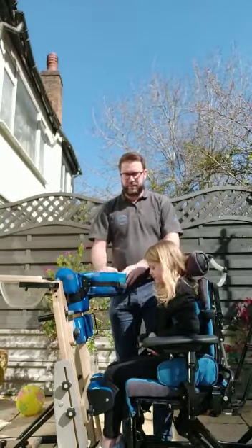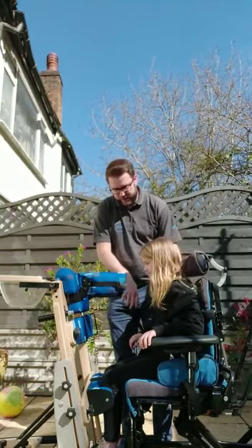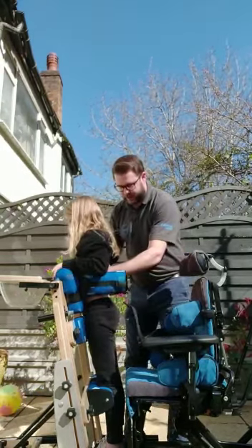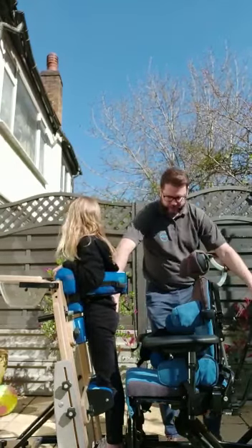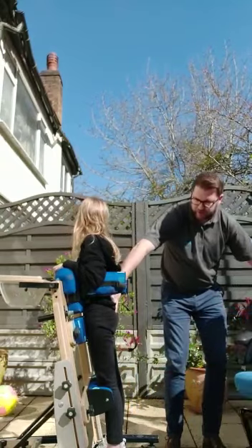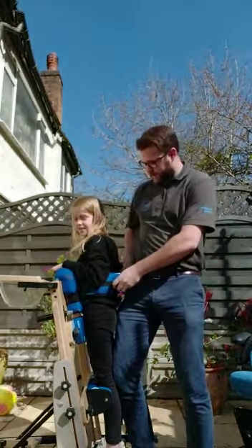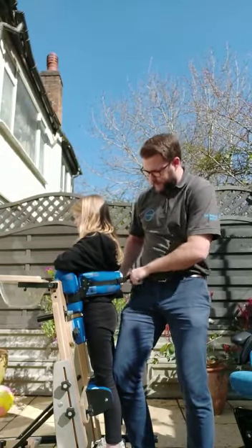But if your child is able to help you, come to the side and lean them forward, and up we go like that. While you're here, hold them in and bring the chair away. Put your thigh against their hips and tighten that one up.